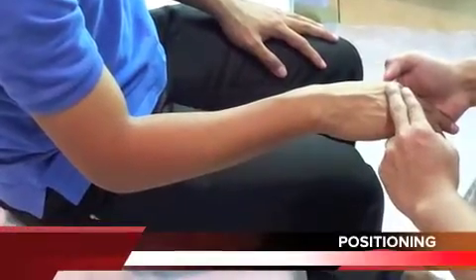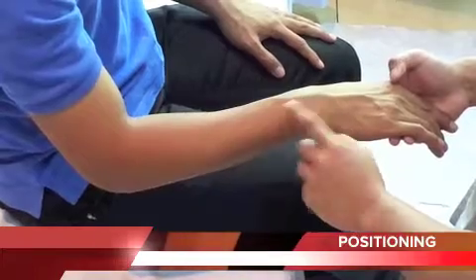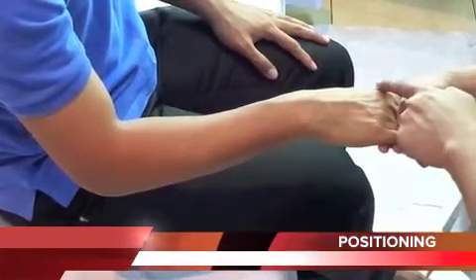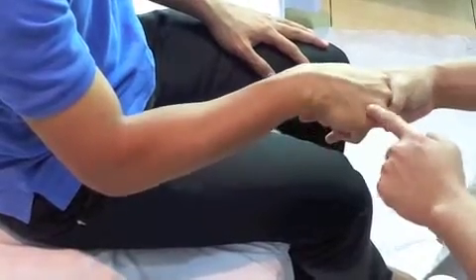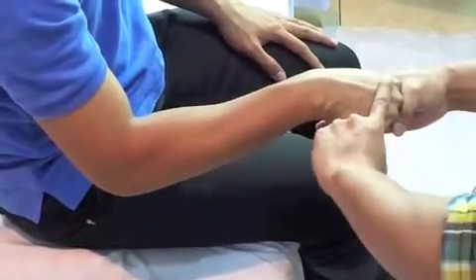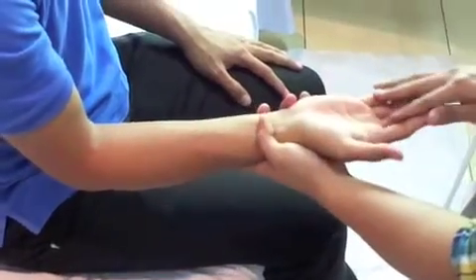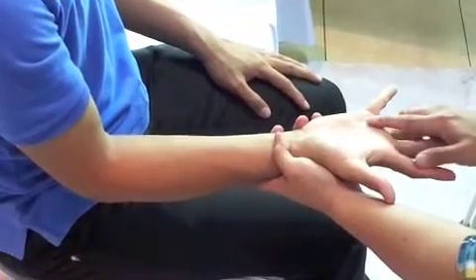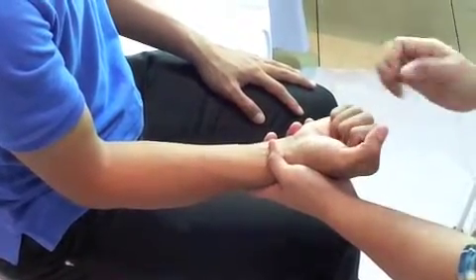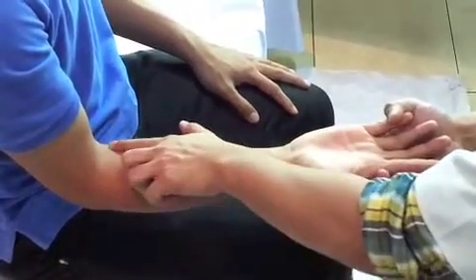Here, we will demonstrate how to apply focused rigidity cast on distal radius fractures. The distal edge is no more distal than the distal knuckle of the hand, so patients can fully flex and extend their fingers.